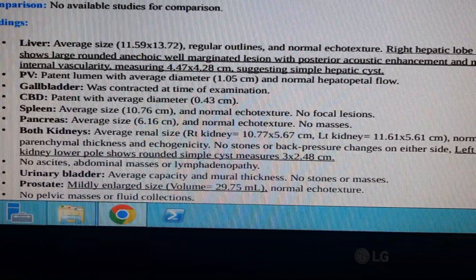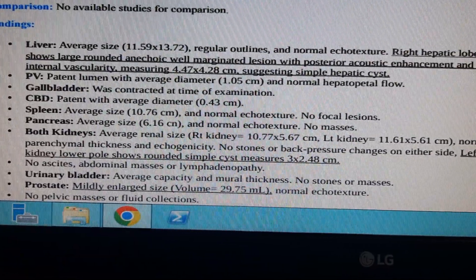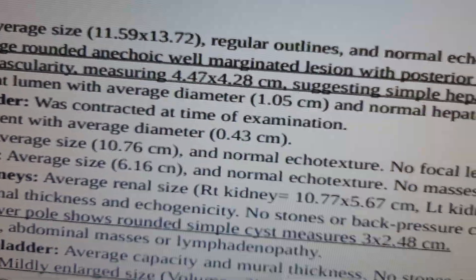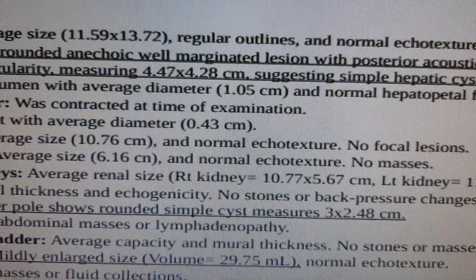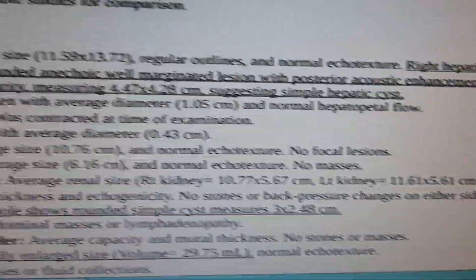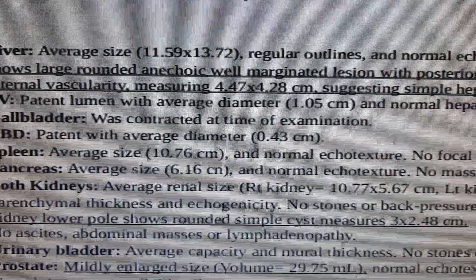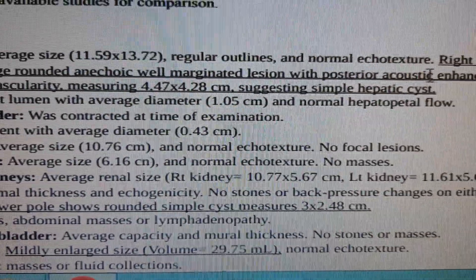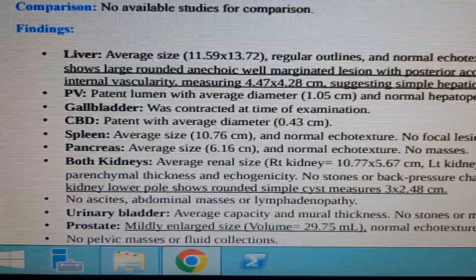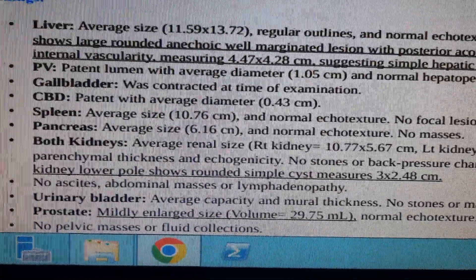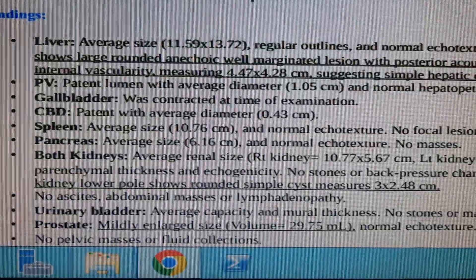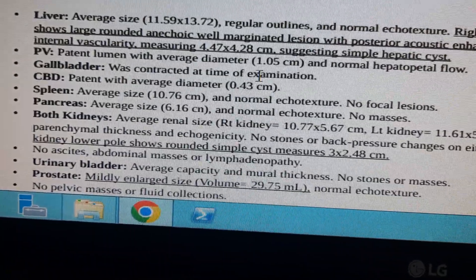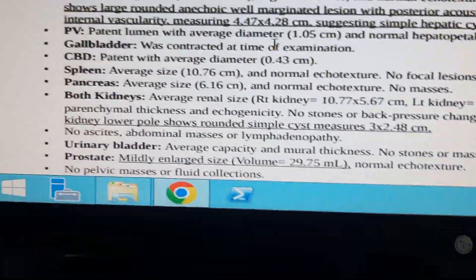Liver: according to the measurement it shows large rounded, well-marginated lesion with posterior acoustic enhancement and no internal vascularity. That is visible on the color Doppler — that measurement is a simple hepatic cyst. A cyst inside the right lobe of the liver.